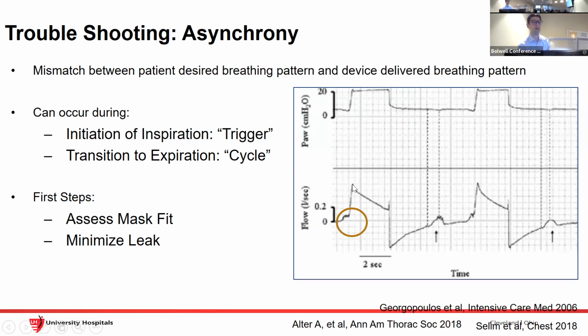It will continue at IPAP, right? As the inspiratory flow decreases until a certain point. You set that point, right? If this is 50% of the peak flow, you see that? If here's 100%, this is, I don't know, maybe 70. Actually, it's closer to.